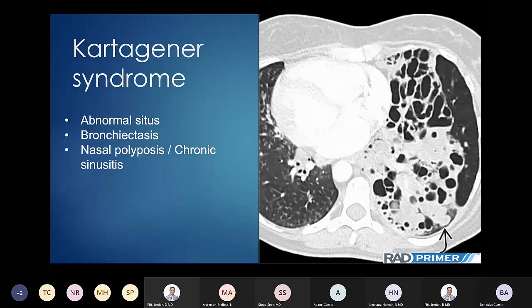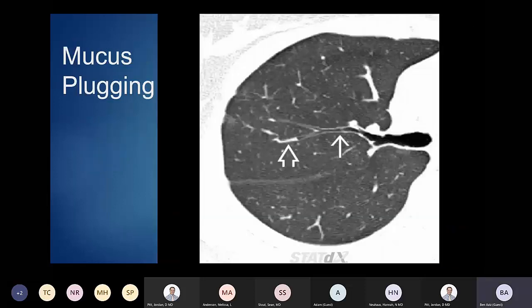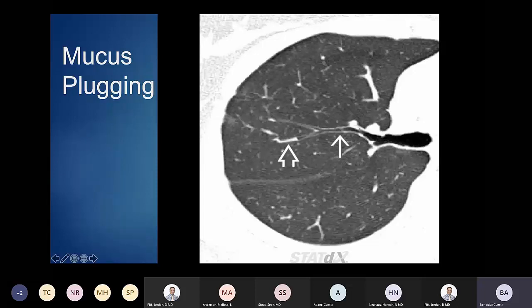Here's a good example of mucus plugging. This is a really good image of a main bronchus going through its divisions and tapering down. There's a little bit of mucus impaction in this secondary bronchus, and then when we get down to this tertiary bronchus, there's a very obvious mucus plug right here.